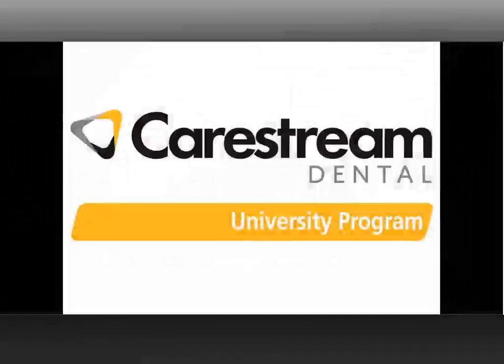Hello, this is Jordan Reese, U.S. Sales Director of 3D Imaging with Carestream Dental. And I'm here with Dr. Shailesh Kottal as part of our Carestream Dental University program. Today, we're going to do a CBCT anatomical review of the mandible.